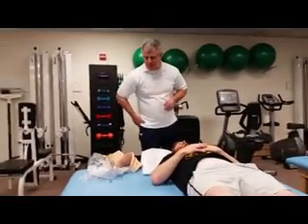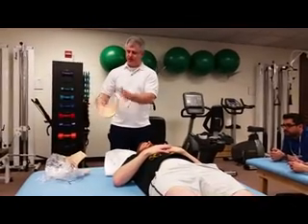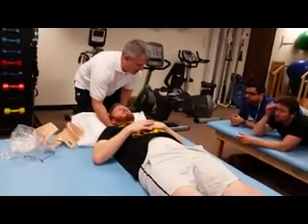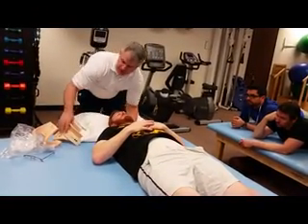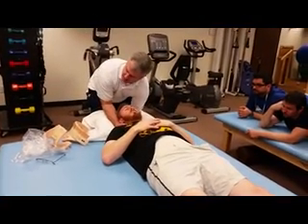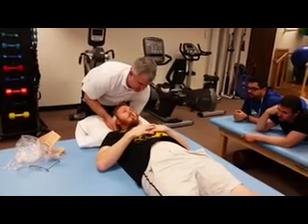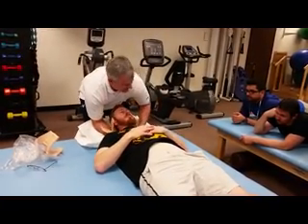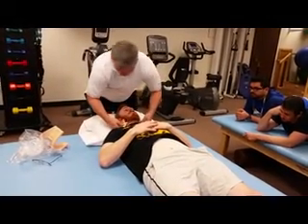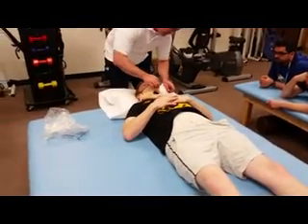Okay, so I've got to make sure that I put this on correctly. I know that this is inferior, this is superior. Same thing, I'm going to come underneath. I'm going to slide the pillow out just a little bit. I'm going to come underneath and try to give a little bit of support in the upper back, and slide under. Since Chris is so tall and long, I did pretty good on this one. Now I'm going to come underneath.